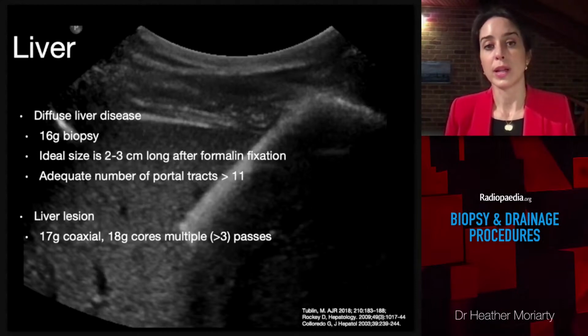Studies in patients with viral hepatitis showed that grading and staging accuracy is reduced in biopsies less than 2 or 2.5 centimetres in length.